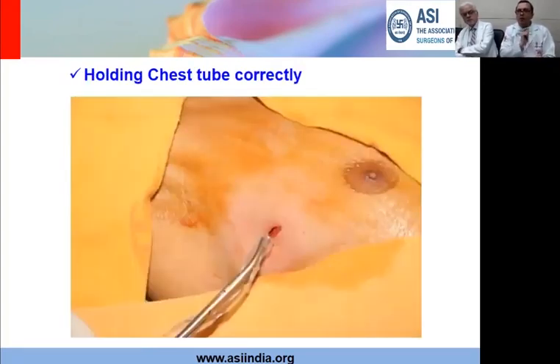The next step is how to hold the tube correctly, having made the hole and asked the patient to stop breathing. Now, as you would see here, the artery forceps or the Kelly's which I am using is not protruding beyond the chest tube. It's just stopping a few millimeters short of the chest tube. So it will act as a trocar to put the chest tube, but at the same time, inside, by chance if the lung was to be close, what will hit the lung is the chest tube and not the artery forceps. So it's important that you hold it in such a way that your artery forceps is a few millimeters before the end of the chest tube, and the chest tube end is protruding.